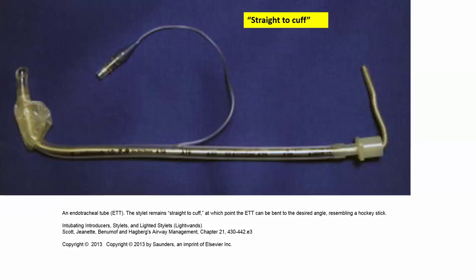I'll bring to your attention that this particular stylet for intubation is quite a lot thicker than the ones we're used to, and it's quite malleable.